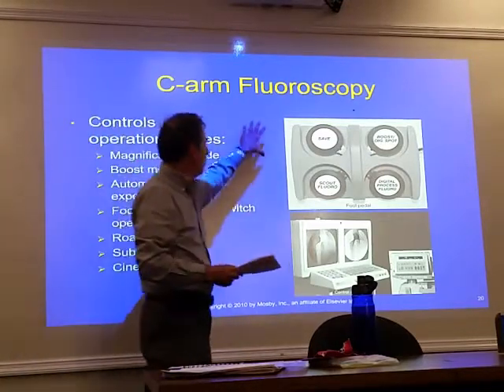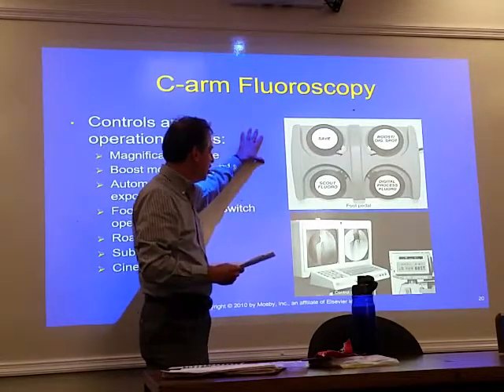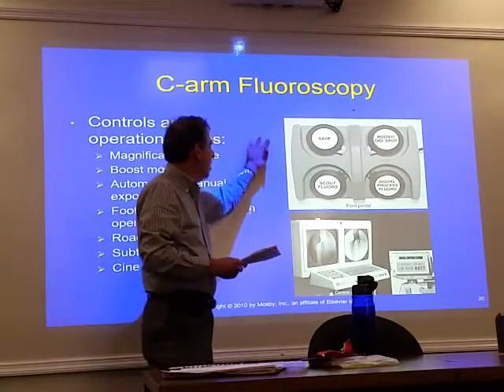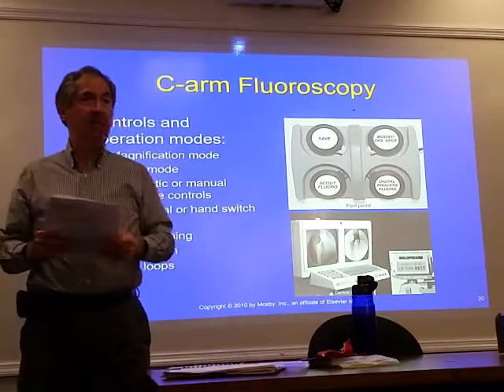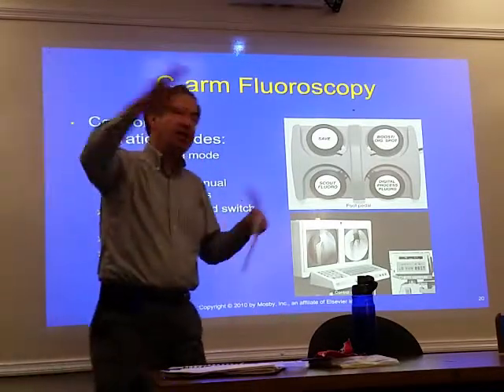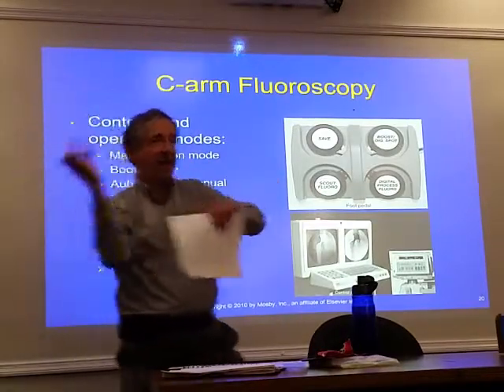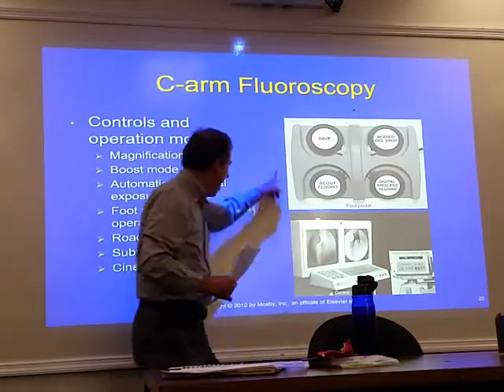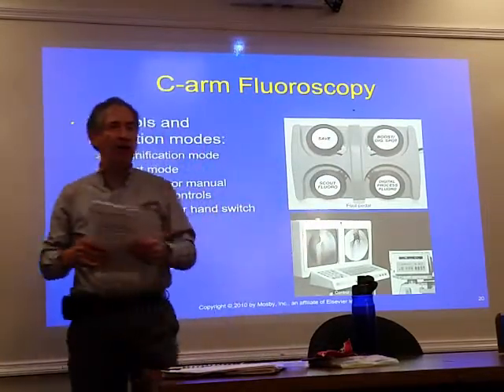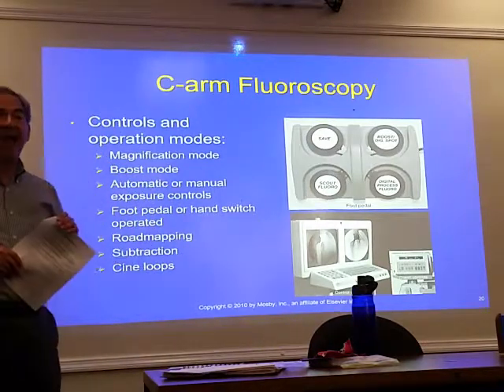It's not like the top part, the proximal, the superior part is visualized, then the distal. They'll keep it as dark as it can be throughout the whole vessel so you can see it. It's kind of like a picture of a car driving over a bridge at night with the red lights. You can see the trail of lights. That's what it looks like. You're able to see its opacification all the way through the vessels. The doctors love that.